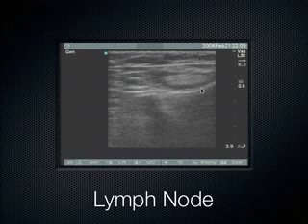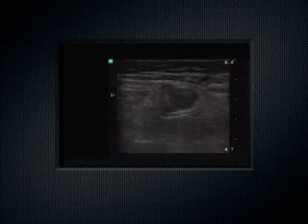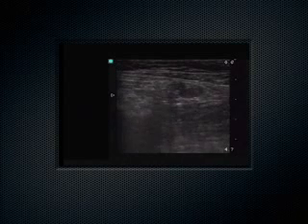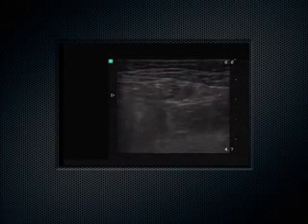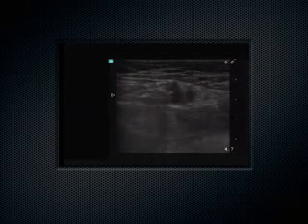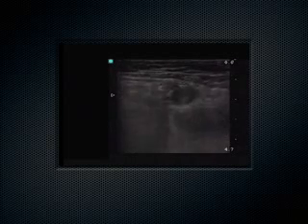That's an inguinal lymph node. Correct. Inguinal lymph node. That's enlarged. Prominent. Usually you don't really see them. But this one looks like a little miniature kidney or something. They're very vascular, too. If you put flow on them and you turn down the pulse repetition frequency, something we're going to talk a lot more about next year, you can make the flow very sensitive. You can see those lymph nodes really light up. They're cool. So this is a little old lady that came in complaining of leg swelling.